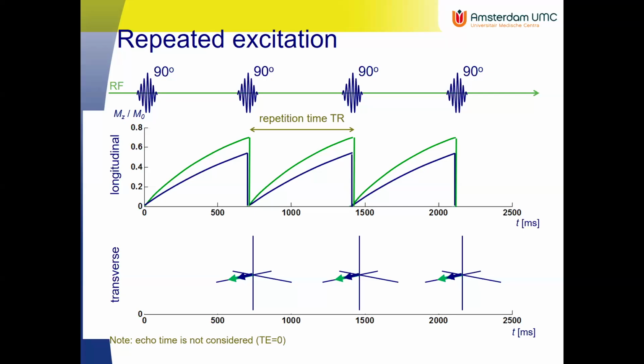And it's also the reason why the MR scans take rather long. A typical MR scan would take a couple of minutes, maybe 5 minutes to scan the full brain. You need about 5 minutes on a modern MRI scanner. And that's also because you repeatedly do the excitation pulses and you repeatedly measure that signal to build up the MR image.